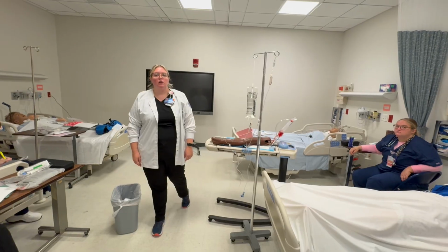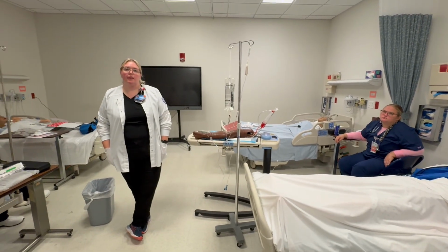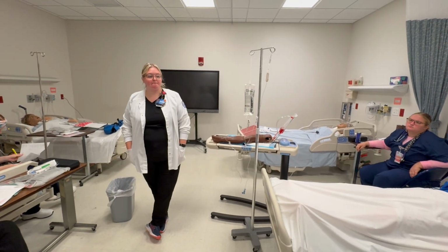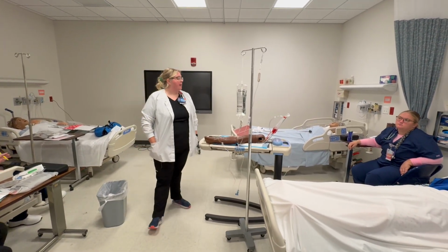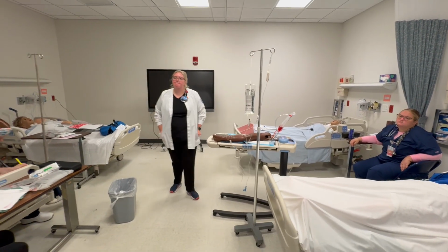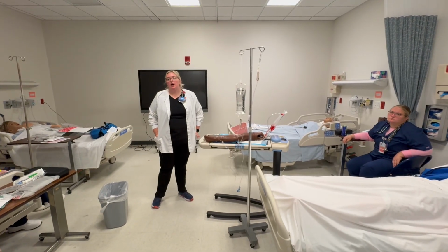So you do the medication check, the 6 rights, in the med room, at bedside, and then right before you give the medication? Mm-hmm. Okay. Yep. And then in our checkoff, is there a certain number of drips that we're supposed to have? No, you guys aren't going to be counting that. Just make sure it's dripping.